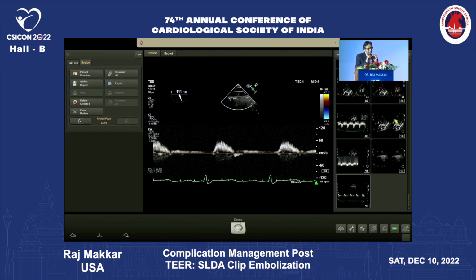All right. So, as you saw, complete abolition of aortic regurgitation. You saw the mechanism of deployment. The hemodynamics are excellent, and you saw what the hemodynamics were, right? The aortic diastolic pressure and the LV diastolic pressure were practically meeting each other before the valve replacement, and you saw how they actually separated with the diastolic pressure going up and the LV end diastolic pressure going down.